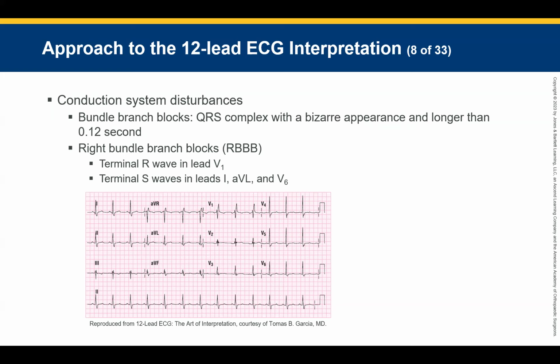But we have lead 2 printed down here at the bottom as an ongoing picture. So freaking handy if your monitor does this. So your lead 2 is a whole full strip down here, yeah. Great. Why is that so important?